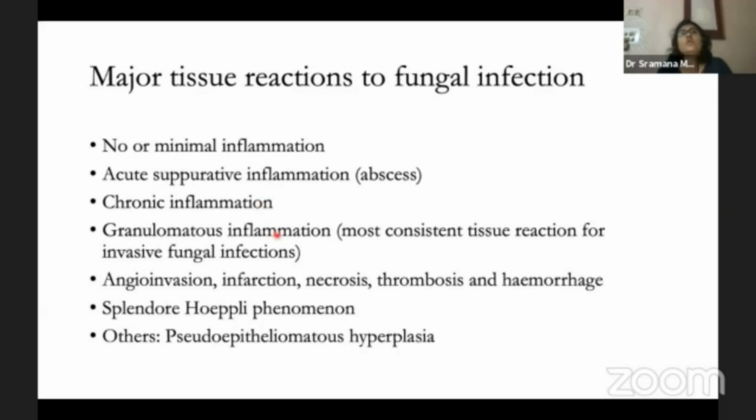Granulomatous inflammation, where the hallmark is formation of granulomas, can be seen, and that is possibly the most consistent tissue reaction for invasive fungal infections. In granulomatous inflammation, we see a variety of granulomas: necrotizing granulomas, non-necrotizing granulomas, suppurative granulomas. So I'll take them up all according to the course of the lecture.